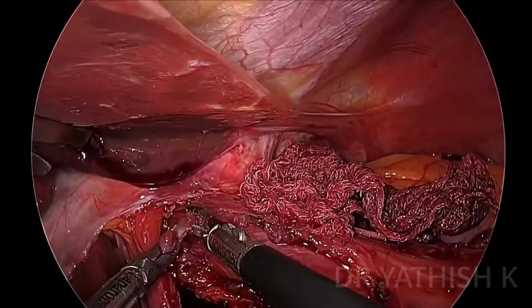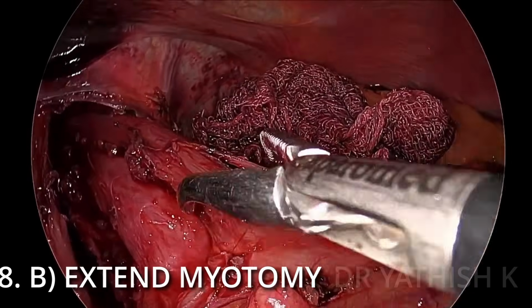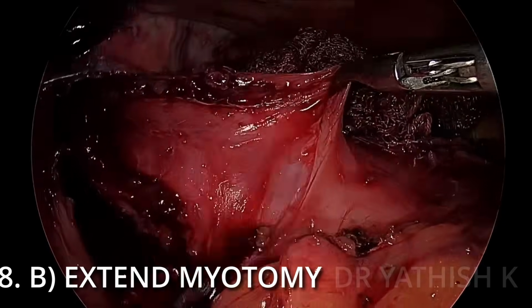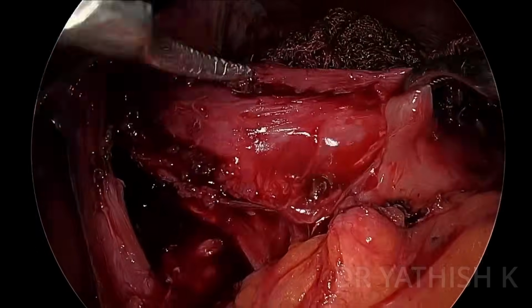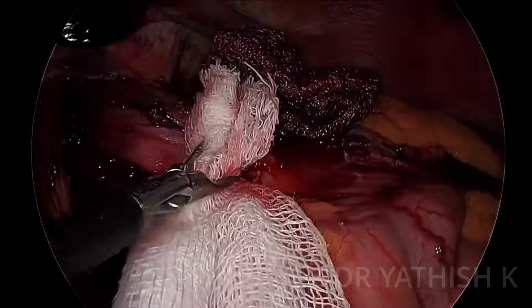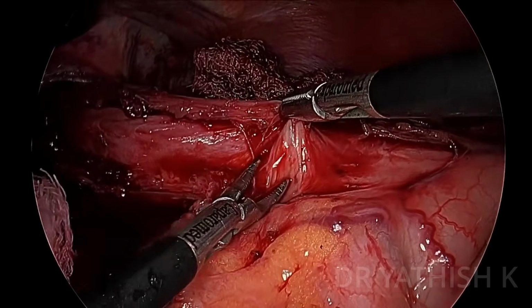Because a proper graded muscle retraction can create a very good esophageal myotomy. Now shifting to the cardiomyotomy. So basically the length of the esophageal myotomy should always be around 5 to 7 centimeters, and the cardiomyotomy is again around 2 to 3 centimeters. So the total length of your myotomy should almost be equal to 9 to 11 centimeters.